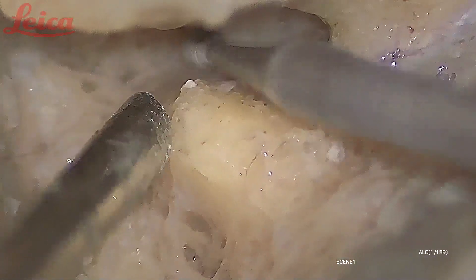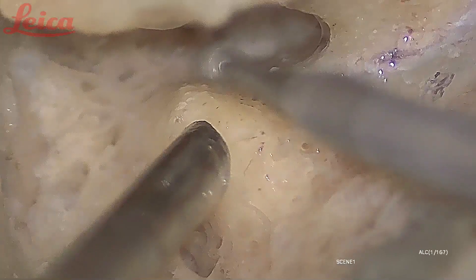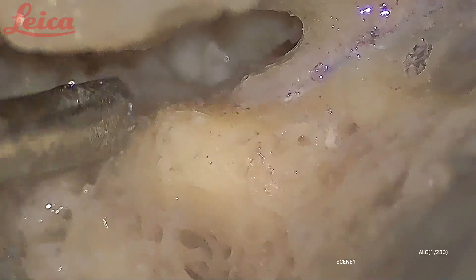This is a very narrow area in which we have to work. On one side you have the lateral semicircular canal and on the other side you have the stapes. You have to be very careful while working there, and also be careful about any dehiscent facial nerve, because the horizontal facial nerve is very commonly dehiscent. One of the complications of facial nerve surgery is damaging the normal nerve fibers — always be careful not to damage them. Try to expose the nerve as widely as possible; at least 180 degrees of exposure is good to get good results following facial nerve surgery.